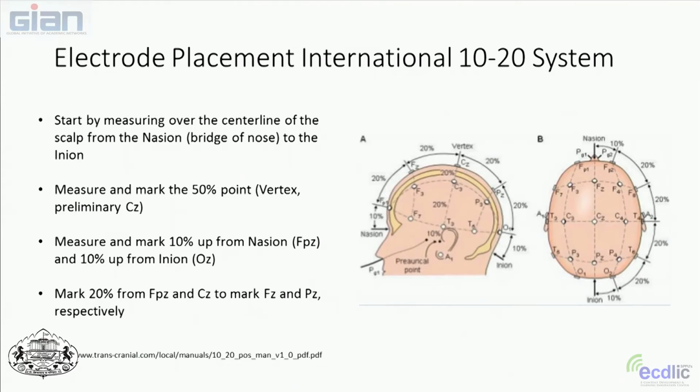We look at a lot of PTSD people, and a concern that we have is when someone's placing these electrodes on their head, they're very close, up close and in your face. So some of these people with PTSD who get nervous by having people so close and crowded into them are sometimes more difficult to place electrodes on. You need to be considerate of how they feel, and you don't want to get them overwhelmed or freaked out, so to say.